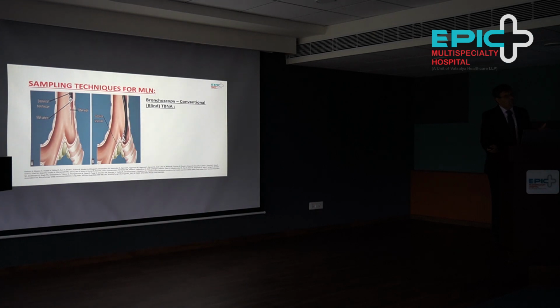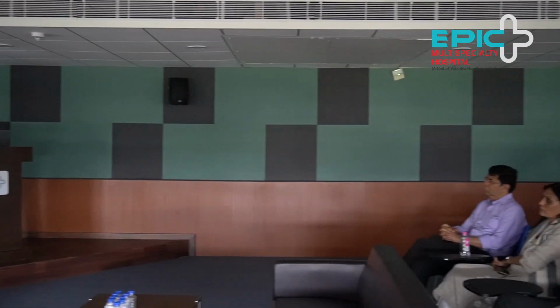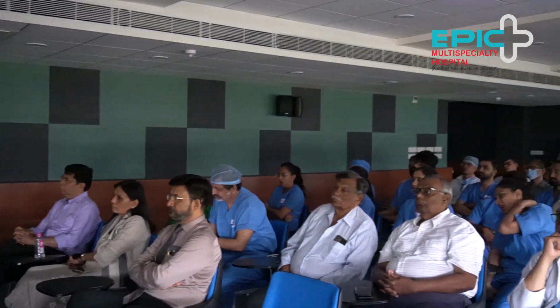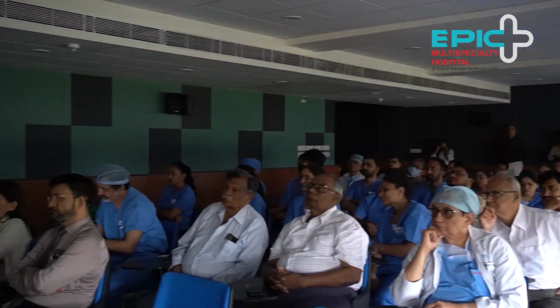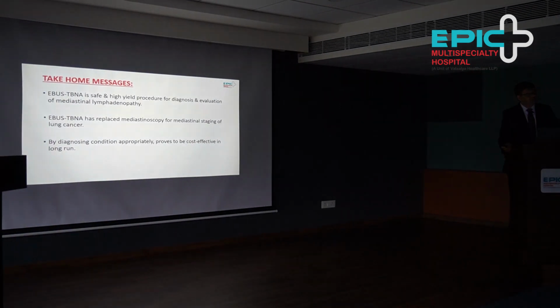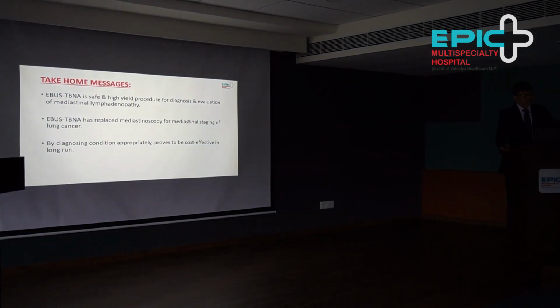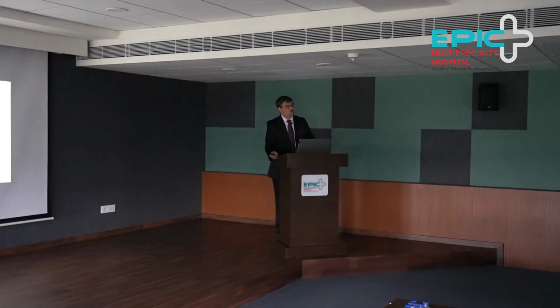Again, a head-to-head comparison was done between the conventional or blind TBNA and EBUS TBNA. The yield was significantly higher with the EBUS TBNA because we get real-time guidance, and hence EBUS TBNA is the standard of care. So finally, I conclude my talk with take-home messages. First, that EBUS TBNA is a safe and high-yield procedure for diagnosis and evaluation of mediastinal lymphadenopathy. It has replaced mediastinoscopy for lung cancer staging, and by diagnosing condition-appropriately, it is cost-effective in the long run.